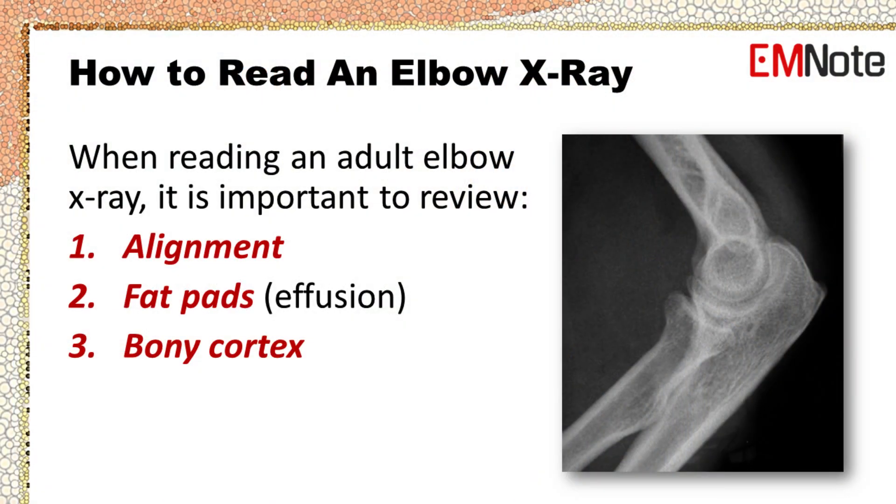Reading an elbow x-ray can be challenging, especially when trying to identify fractures after an acute elbow injury. A systematic approach can aid in the radiographic recognition of occult signs of injury. Here are the steps to follow when reading an adult elbow x-ray.